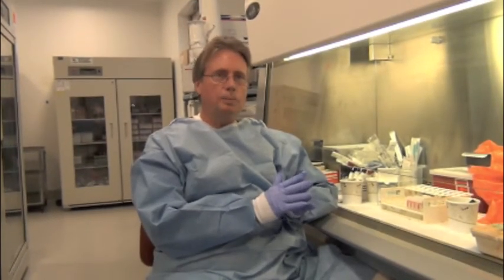Okay, this is Friday. We're going to be doing DNA probes for the different Mycobacterium. Yesterday we ran pyrosequencing. Anything that didn't work on pyrosequencing, we have probes to rule out Mycobacterium tuberculosis, MAI, Mycobacterium gordonae, and if we think we have a Mycobacterium kansasii, we have a probe for that. So we can only rule out those particular ones. Pyrosequencing will go ahead and key out any Mycobacterium. So anything that didn't work, we will still try to rule out those particular ones.